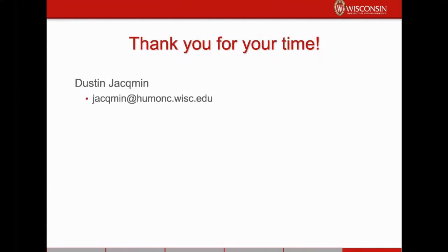Our next question, how much time should one expect to budget to do all this? Sure. So the first time I did it for a TrueBeam, and that TrueBeam had 5 beam energies, so 3 unflattened and 2 flattened energies, and then it had 5 electron energies, preparing all of that, taking the measurements and doing the analysis took about 80 hours.